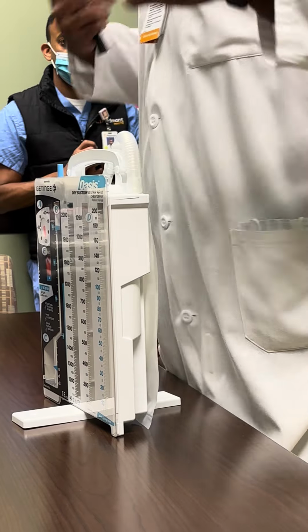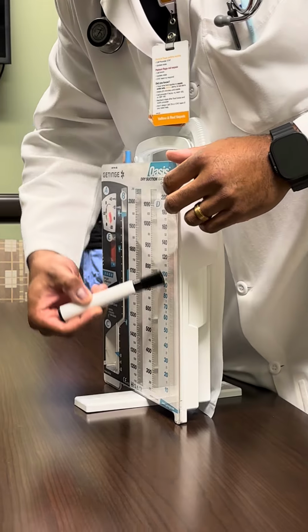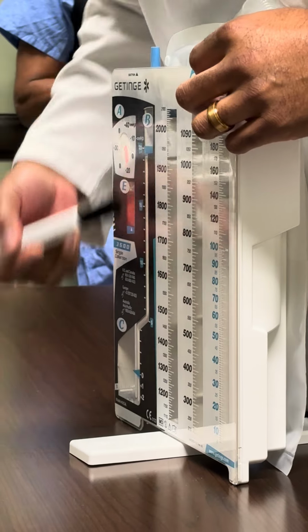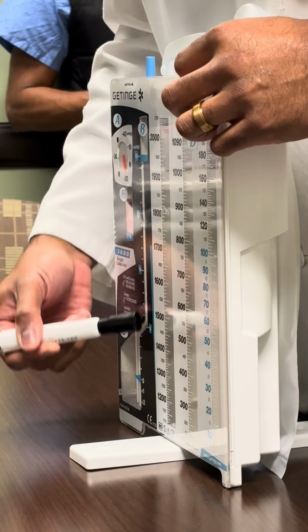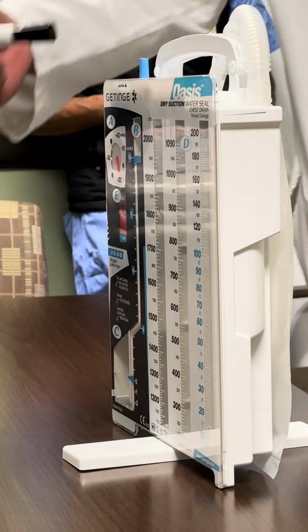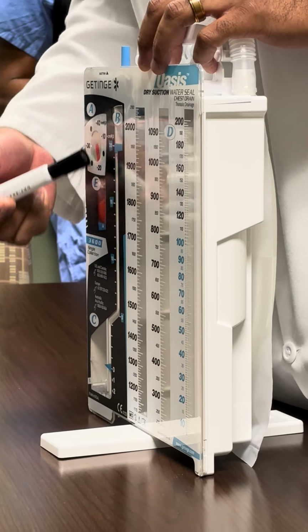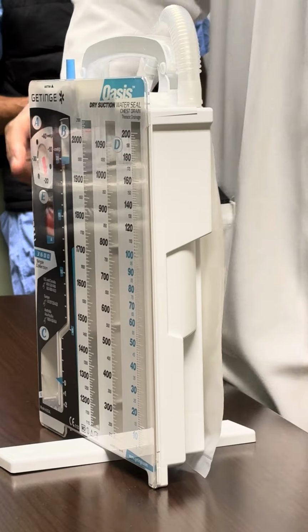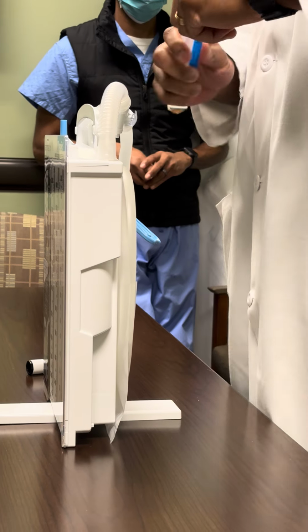And so you have these 3 bottles now in this system. You have your collection bottle or your collection chambers, okay? You have your water seal chamber, and then you also have your suction bottle chamber, okay, that you can use to connect this. And so I just took it out of the box, or the packaging, and again, very remedial.